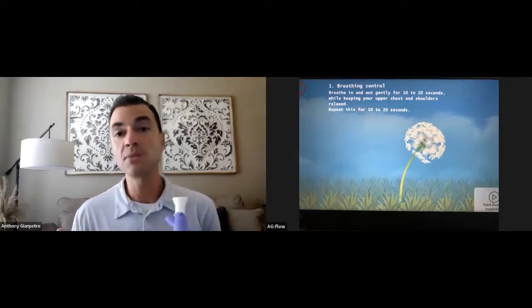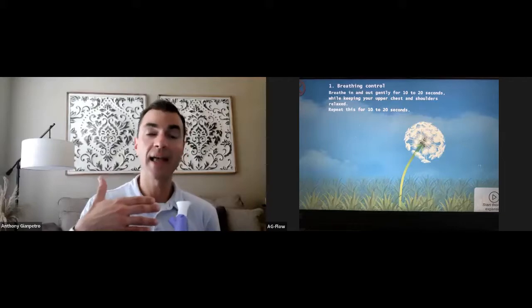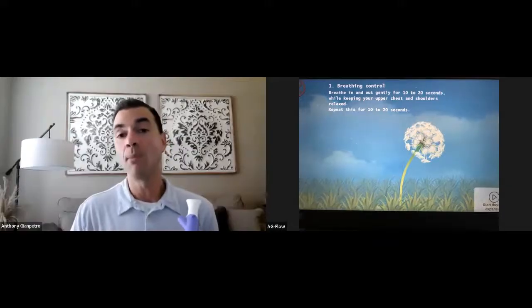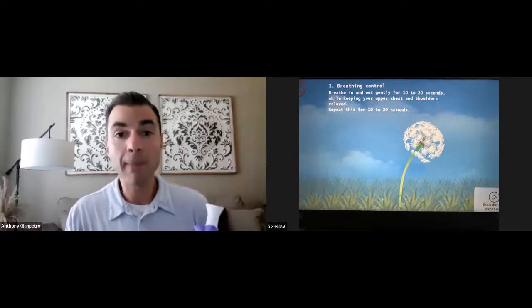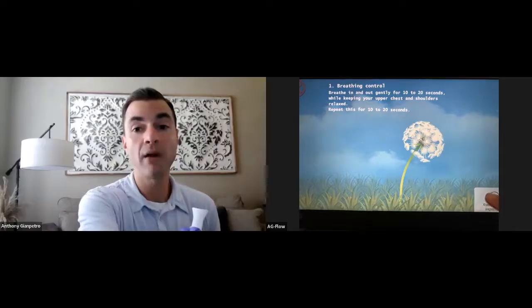So again, you should see some similar carryover to that of Starry Road if you did it with them, in that it should be about a 1 to 3 second inhale, 2 to 6 second exhale, and you're going to see this nice left and right, and hopefully a good belly breath for step 1. You do not have to do this for any set amount of time. It's just recommended for maybe 10 or 20 seconds, and then move on to the second stage, which you can see in the lower right of the screen.